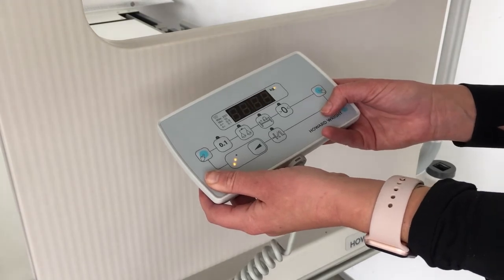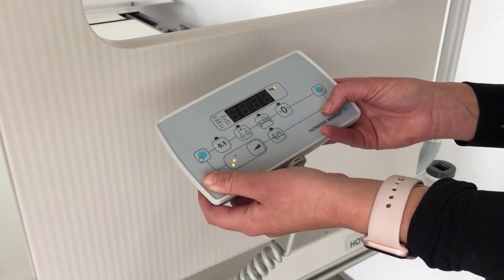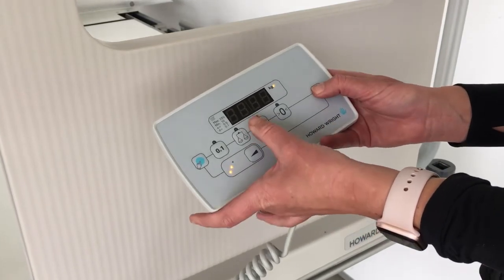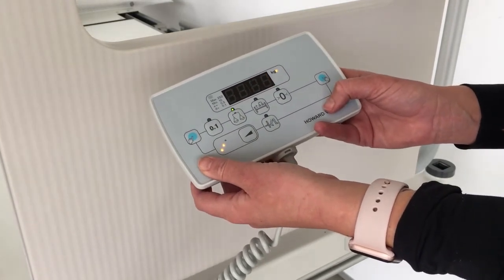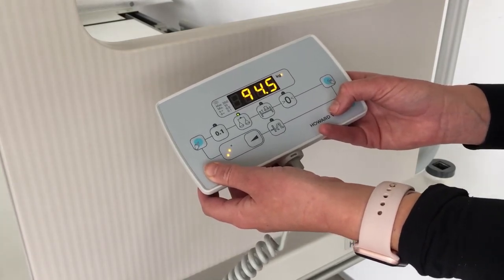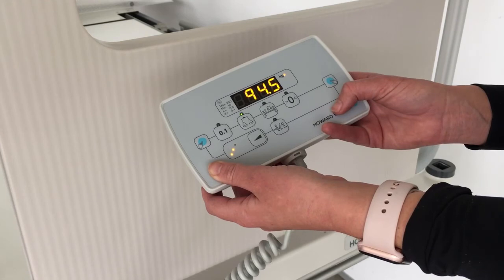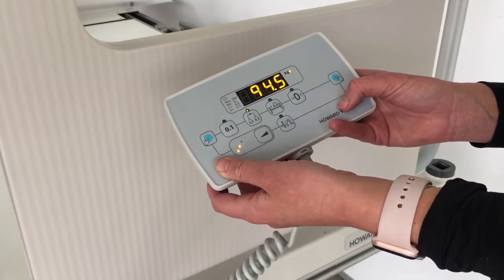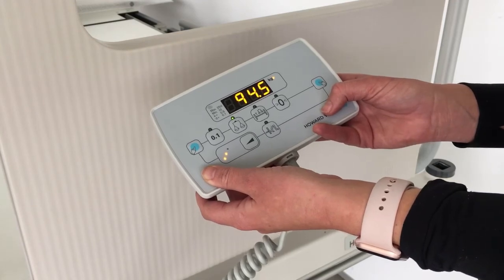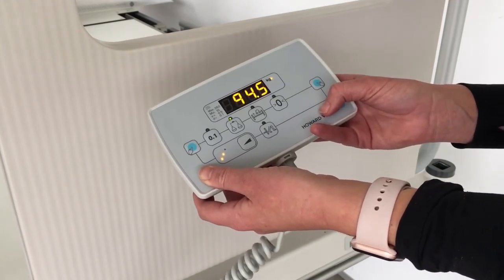The display will flash and zero will display. To weigh the patient, place the patient on the bed and press the weigh button. The display will flash and the patient's weight will be displayed. If you need to add or remove weight from the bed, use the add or remove weight function. This is useful if you need to add a piece of equipment such as an IV pole or oxygen cylinder carrier.